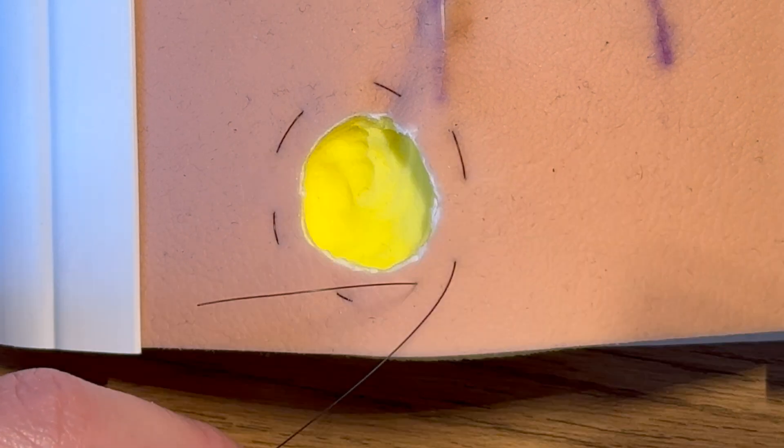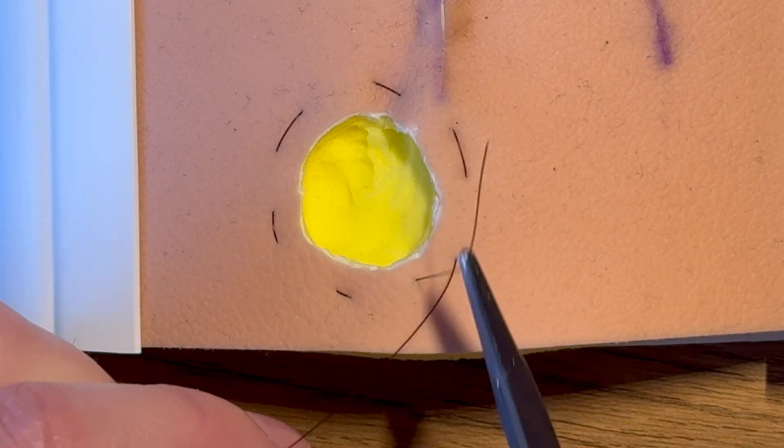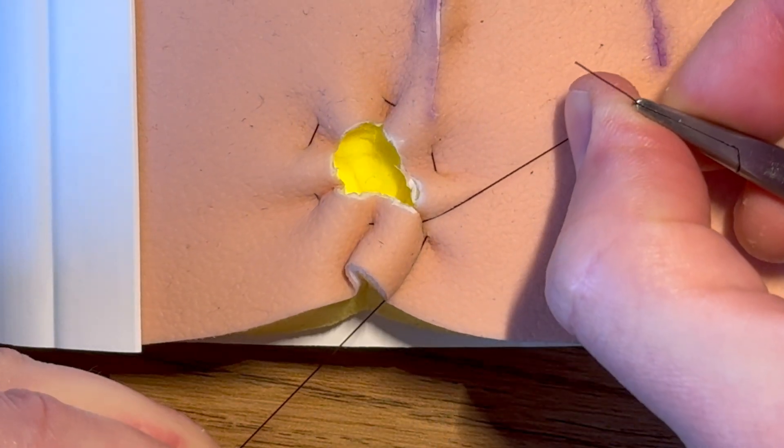All right, so then we've got that sort of appearance which is more really the traditional purse string from an actual purse or old-fashioned purse to put coins in. And then we're going to just tie it up the same as we would anything, but you can see as we pull it together it will draw the wound together in a very similar way.